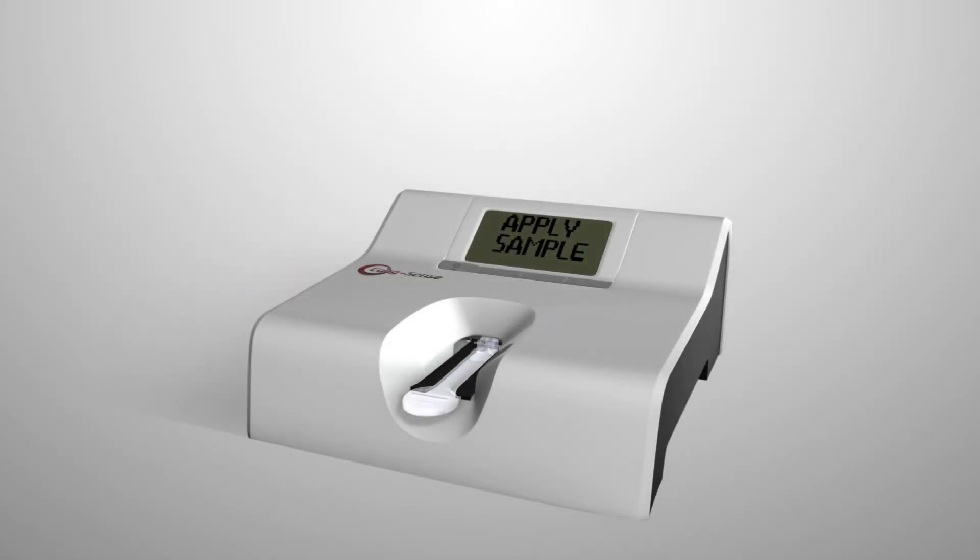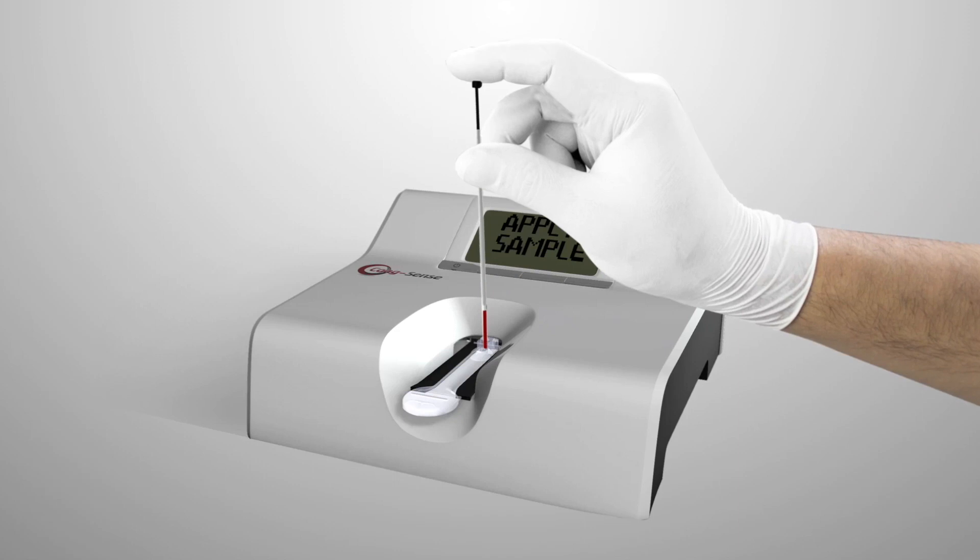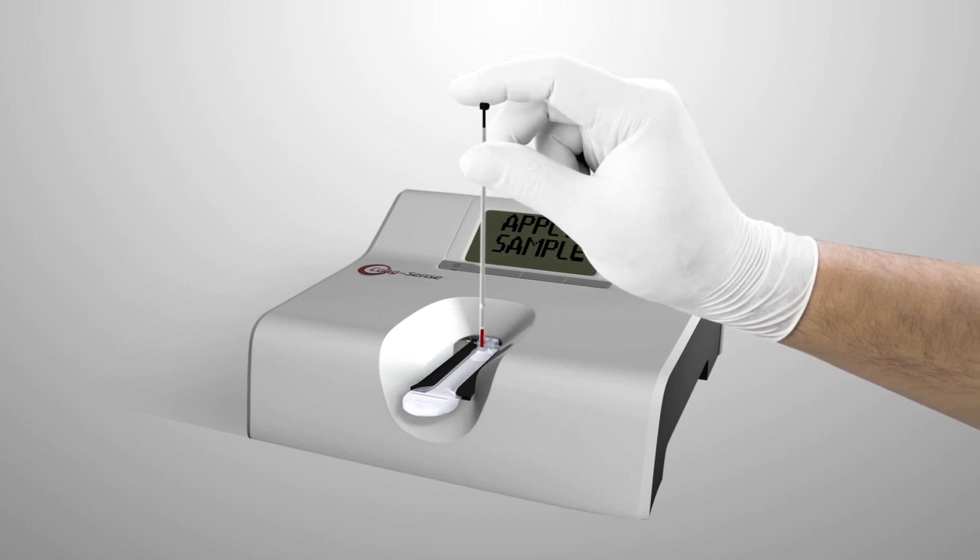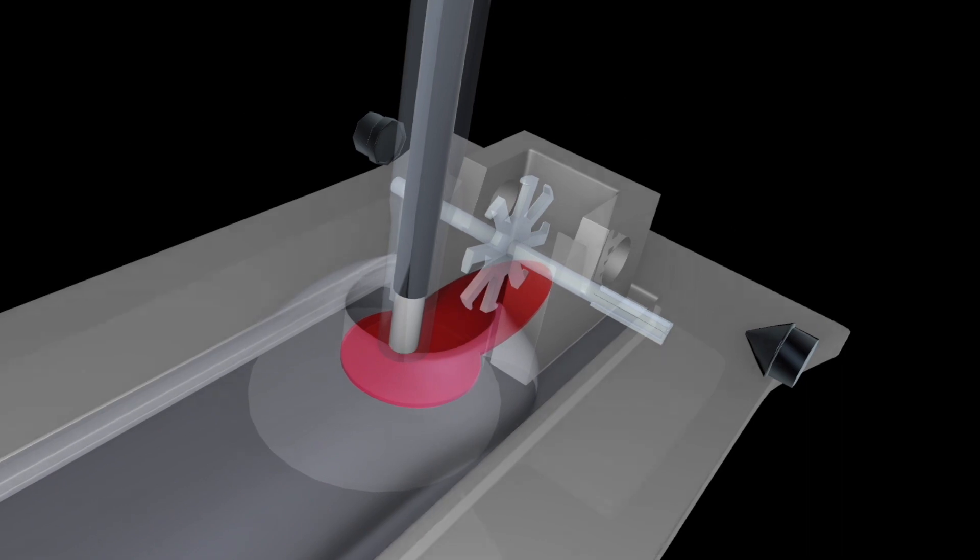Meter display must read apply sample before applying sample. Touch tip of tube down onto test strip sample application well. Gently depress plunger until blood exits tube.